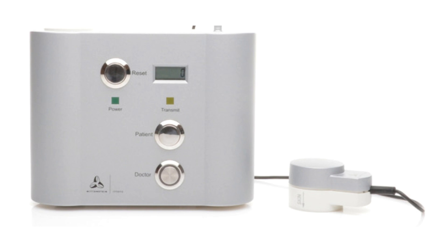This is the control set. As you can see, there are three buttons: one called Reset, one called Patient, and one called Doctor, and a screen showing the number zero.